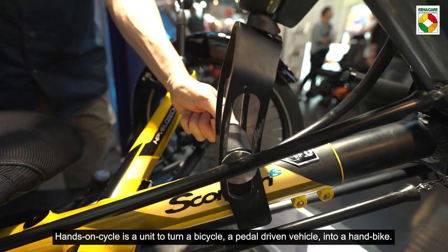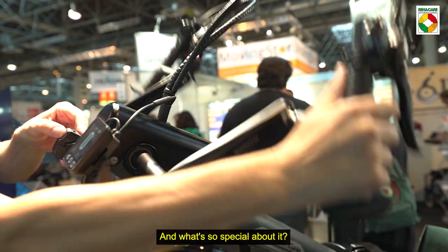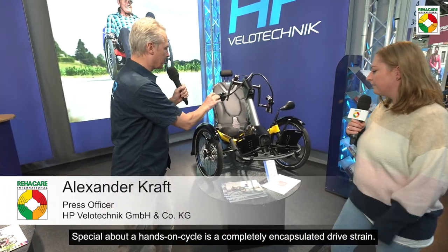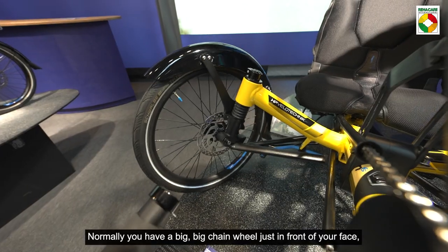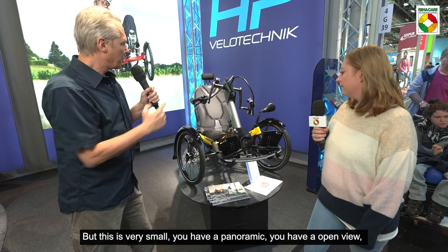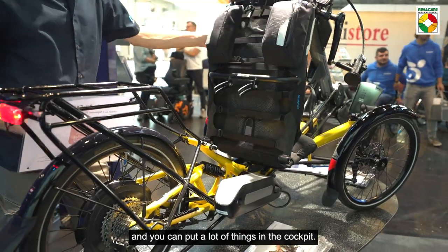A hands-on cycle is a unit to make a bicycle — a pedal-driven vehicle — a handbike. What's so special about it? The hands-on cycle has a completely encapsulated drivetrain. Normally you have a big chain wheel just in front of your face compared to other handbikes, but this is very small. You have a panoramic, open view and you can put a lot of things in the cockpit.